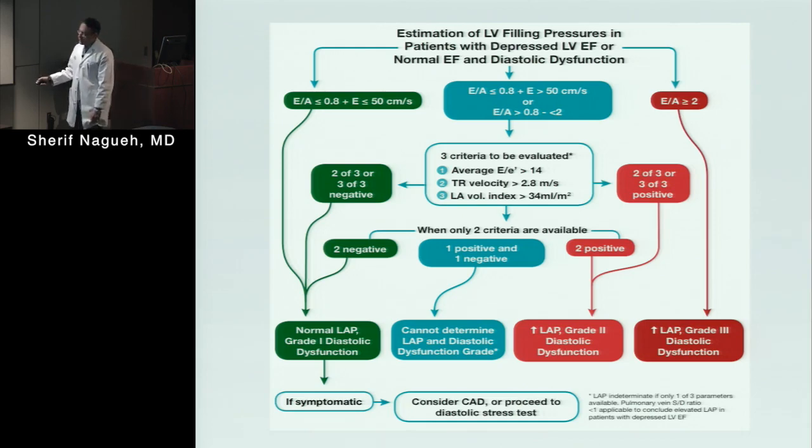One thing also noted in this guideline that is explicit, say we see someone who has symptoms of shortness of breath, and the report comes with a normal left atrial pressure at baseline, which is at rest when it is acquired. Does that rule a cardiac etiology altogether? It should not, particularly if the physician has looked at other alternatives, for example, pulmonary disease. So the recommendations are to consider stress testing to look for CAD, or also consider the diastolic stress test.